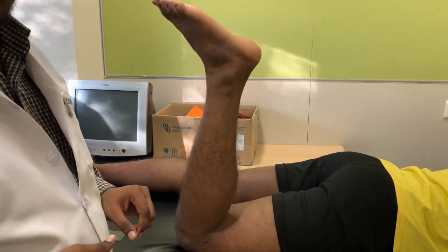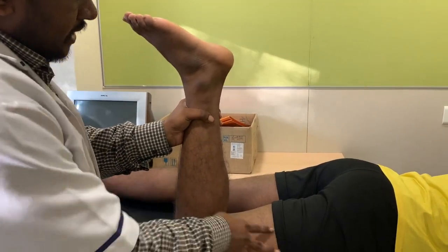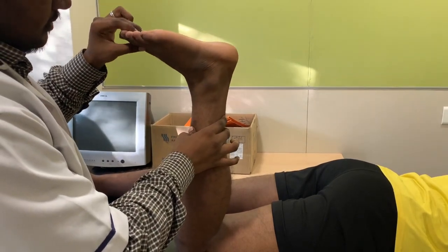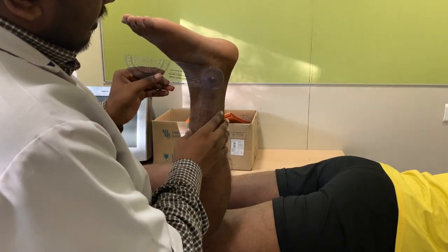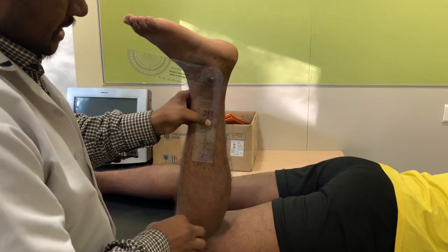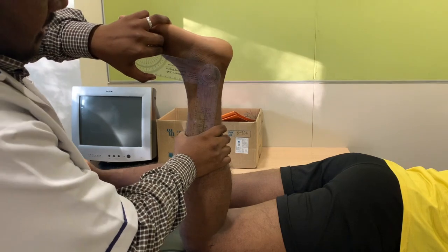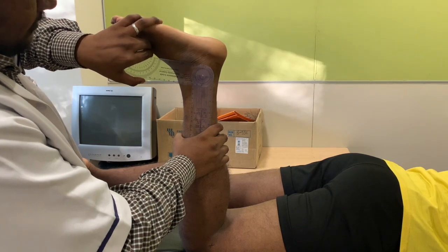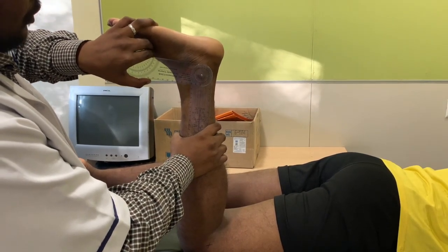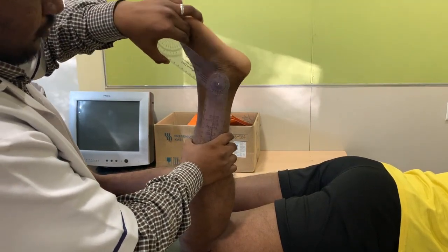For dorsiflexion and plantarflexion, the alternate position to check is to take the subject in prone lying and flex the knee to 90 degrees. Here you can see. Now you can keep the fulcrum on the lateral malleolus, the stabilizing arm on the lateral aspect of the leg, and again you can hold here, and the movable arm should be parallel to the anterior aspect of the fifth metatarsal. From here you can go for dorsiflexion and plantarflexion range of motion evaluation.